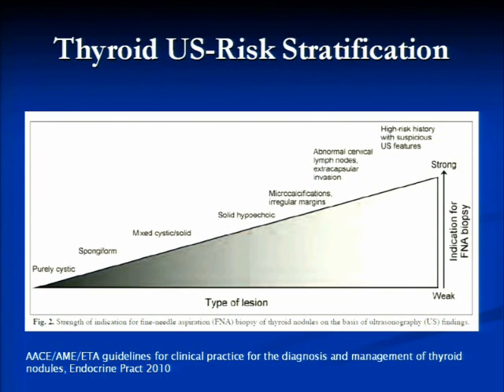And essentially this is how thyroid ultrasonography should be used by all of you in your clinics as an adjunct tool to help decide which nodules look more suspicious and are more likely to yield a positive result in a multinodular gland, and also which nodules that may even be smaller than a centimeter you may want to decide to biopsy in a particular patient, either because of the ultrasound findings, as we've discussed, that are suspicious, or a combination of their personal history, family history, radiation exposure, etc.